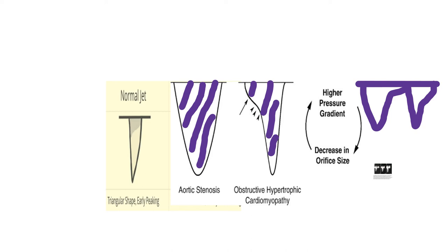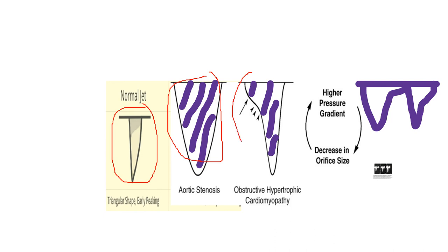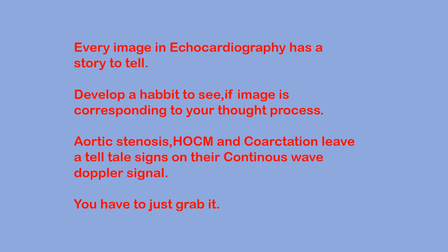Images in echocardiography sometimes leave a lasting impression, and if we sensitize our mind to these images we can easily diagnose the pathology behind the signals. This is the normal aortic valve signal, this is severe aortic stenosis, this is dynamic LVOT obstruction, and this is coarctation with diastolic runoff. To sum up, every image in echocardiography has a story to tell — develop the habit of correlating images to your thought process.